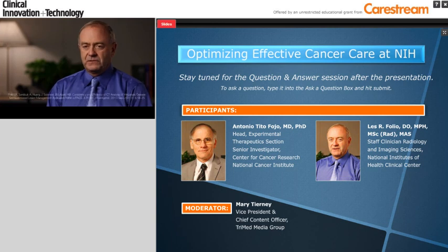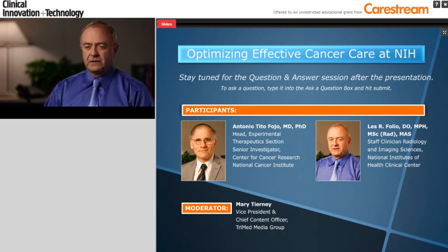With our study in AJR, the American Journal of Roentgenology, we published our experience on applying this new segmentation system in what's called the lesion management application. And the lesion tracking tool is what allows us to take the automated segmentations that are done initially within potentially our workflow to then follow up in one button to be able to find every previous segmented identified lesion and automatically identify and measure in the follow-up exam.